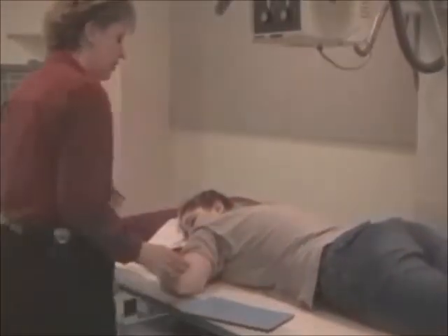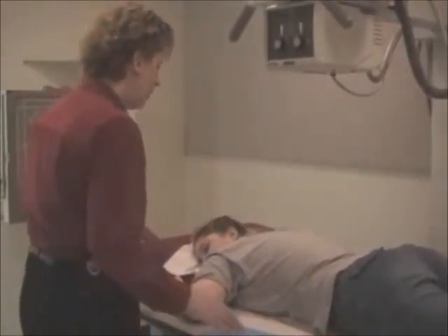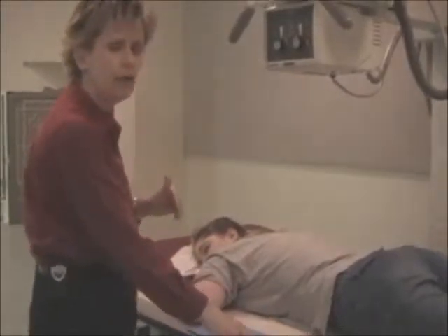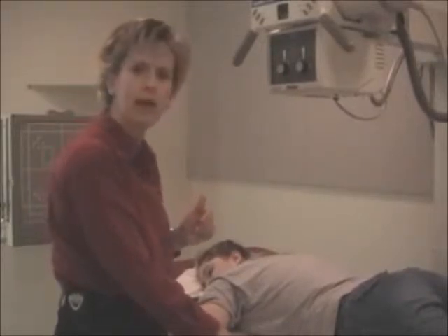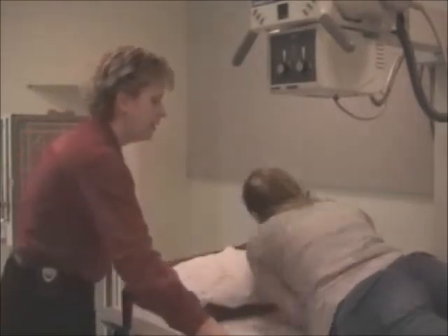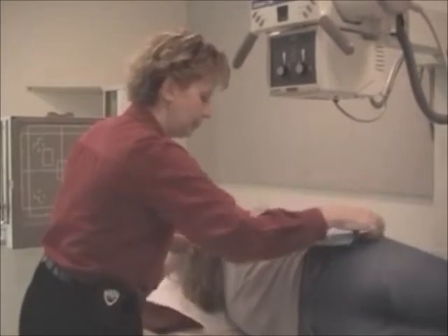Okay, let's go on with another demonstration. Okay, we did a right lateral. We've now done the patient PA. It would be hard for you to see a left lateral, but it would be the same as for a right lateral. Okay, let's try to do it anyway. The camera, I can talk you through it. So, Kristen, would you face that wall for a left lateral? Left laterals aren't real common, but you might see it.